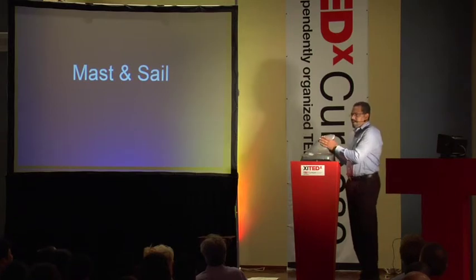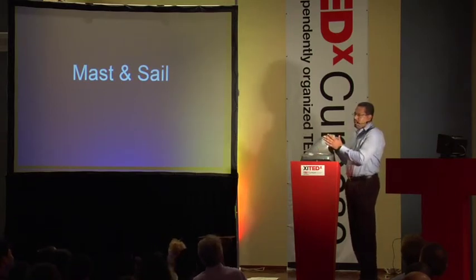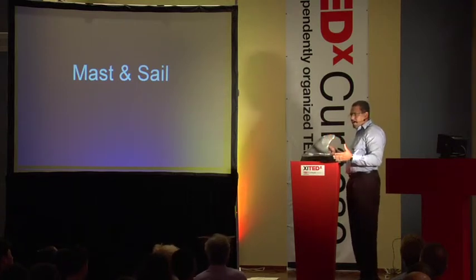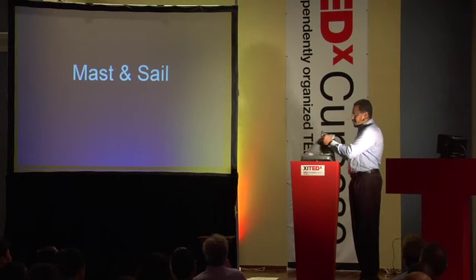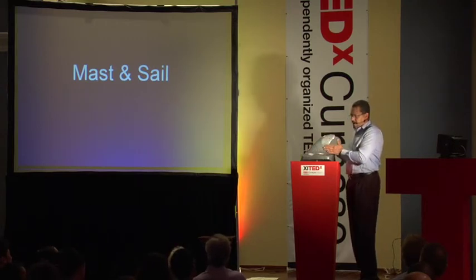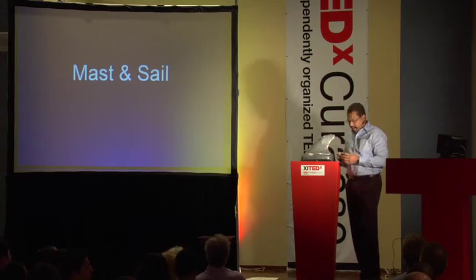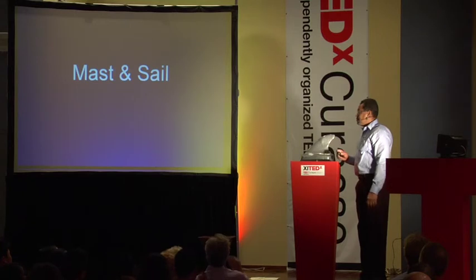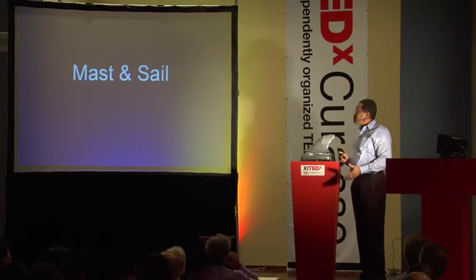Actually, a fin like this is also like a keel of a ship. And on the other side, it's also to maneuver. So you can compare it with the mast in the front, where you have the stronger part and a very flexible part to the back. It's a very important part of the animal to maneuver. That's why we had to do such a big effort to get it fixed.